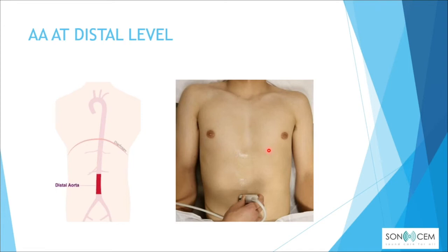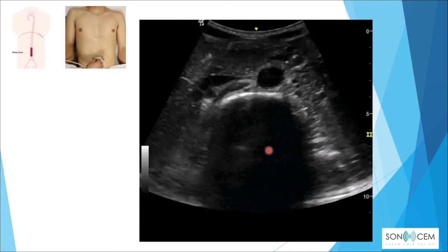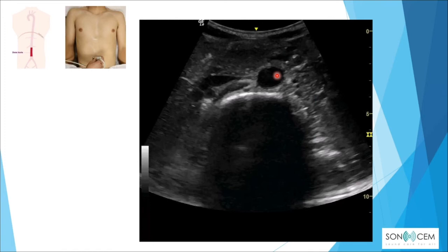Moving more caudally to the distal level, just above the umbilicus level, the aorta will appear more superficial due to the curvature of the spine. To get a proper aorta view, we need to zoom in. For measurement, decrease the depth further to get an accurate reading.